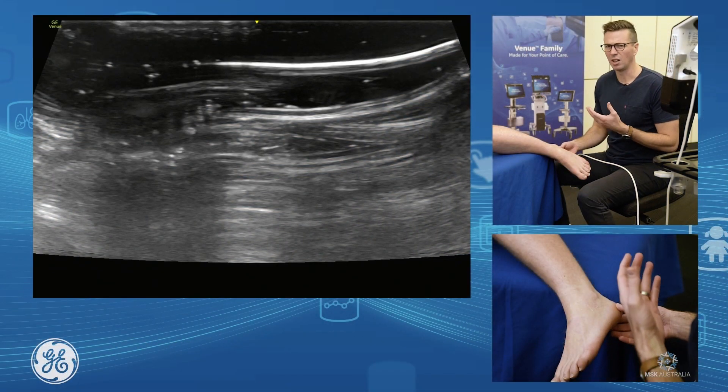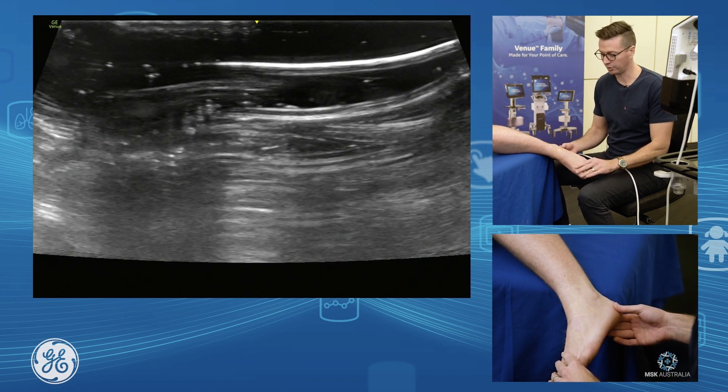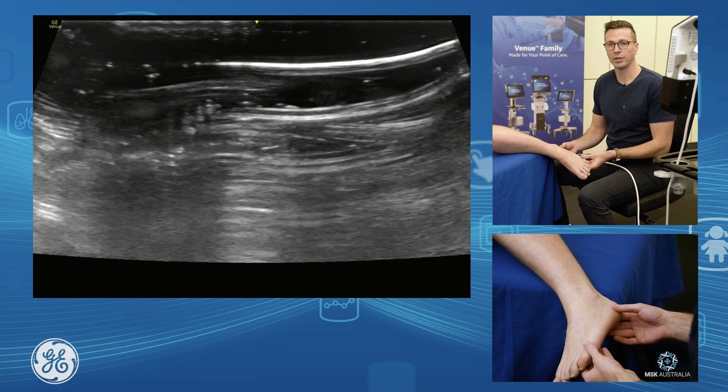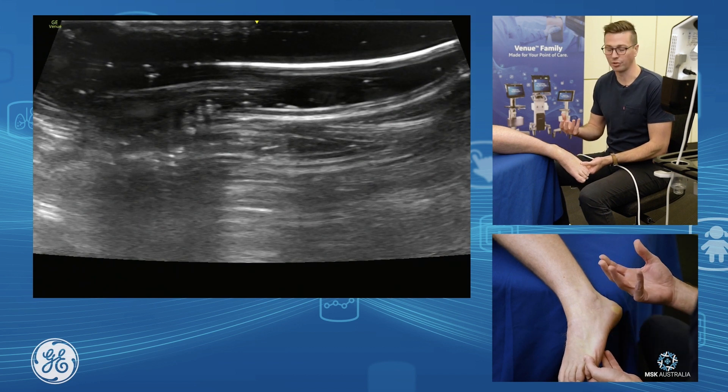Lateral ligament assessment. I like having the patient's foot off the edge of the bed because you need to be able to move it to assess the ligaments, to put them on tone to see them nicely. To assess the lateral ligaments, you need the foot in a little bit of an inverted and plantar flexed position to put those ligaments on tone.